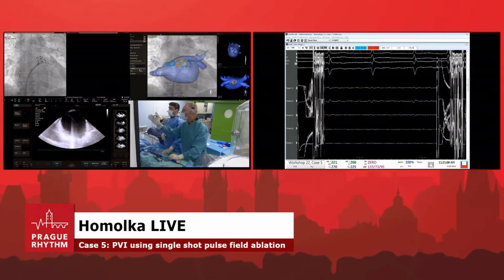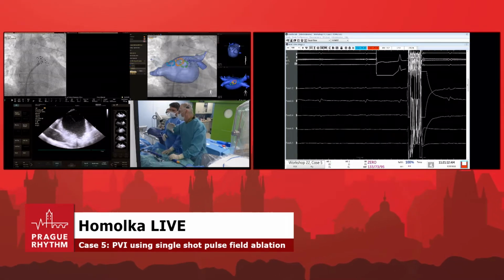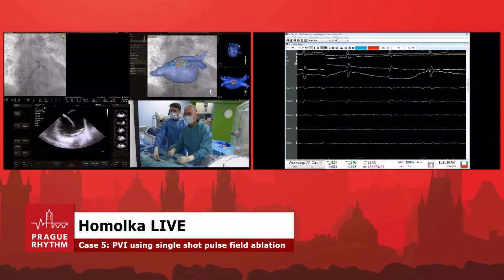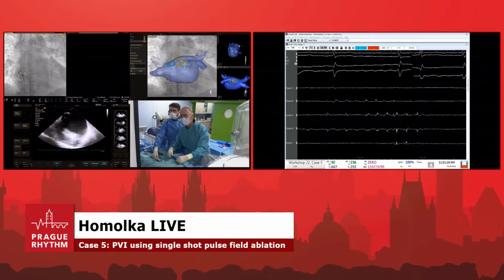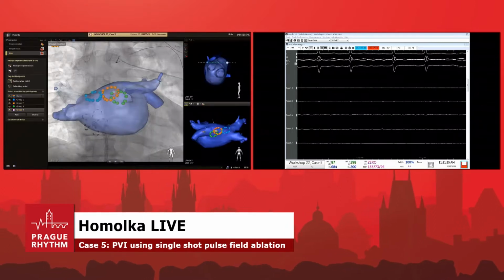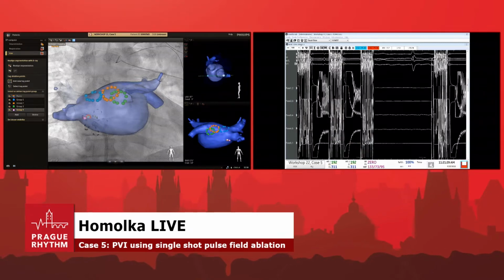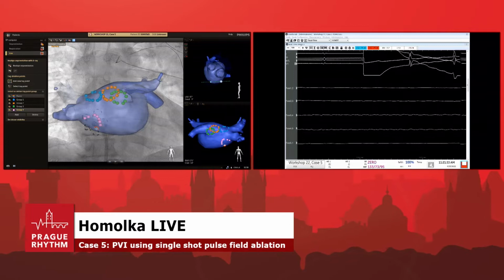I need to connect this left common. So I'm finished with the upper line, the so-called upper line of the posterior wall. Now I'm going to the inferior line, starting maybe on the right side. Right inferior, okay. So very close, so perfect. Let's try to go here. So it's the inferior part of the posterior wall. Mark it. Perfect. One more.